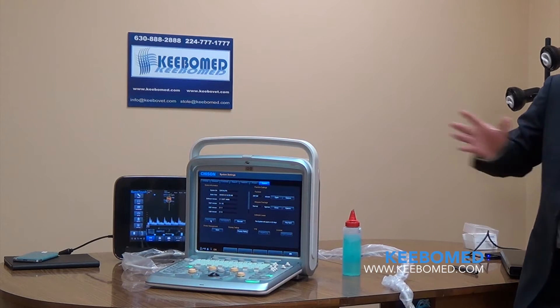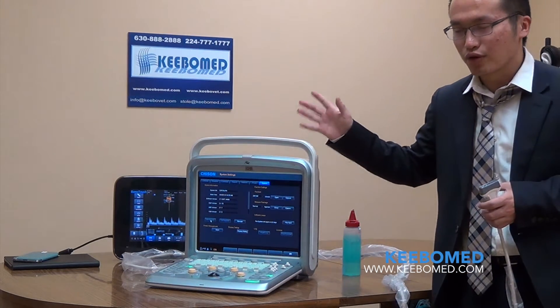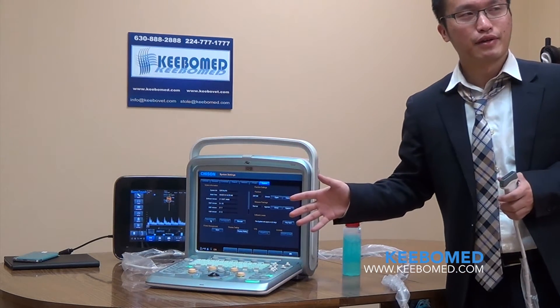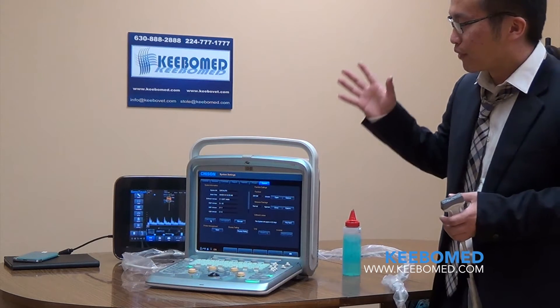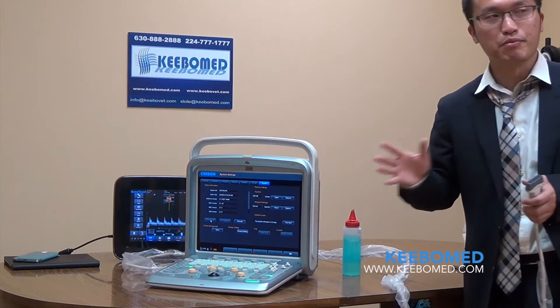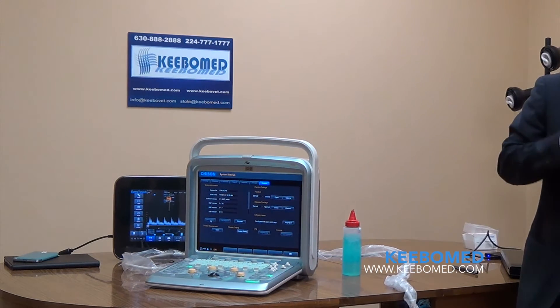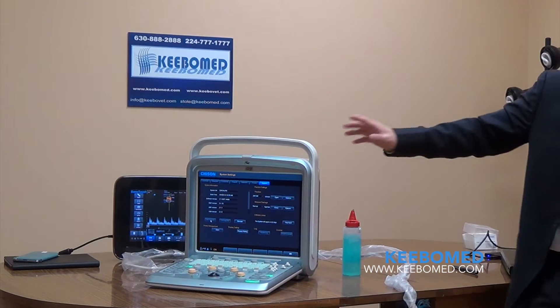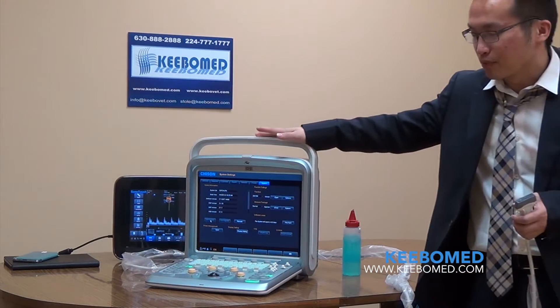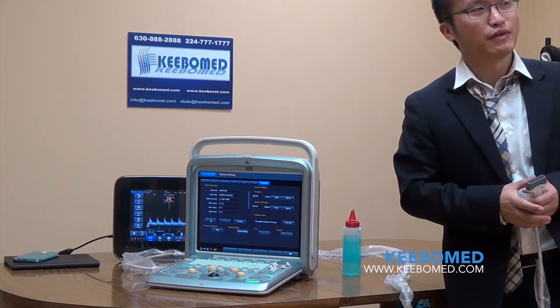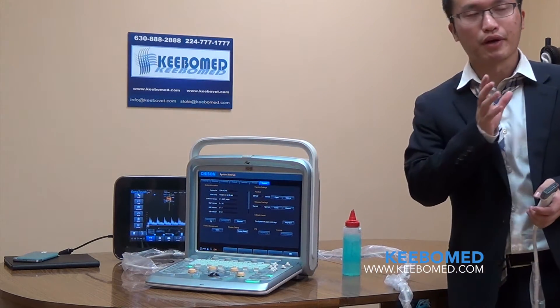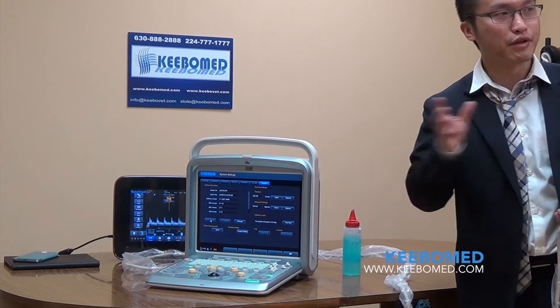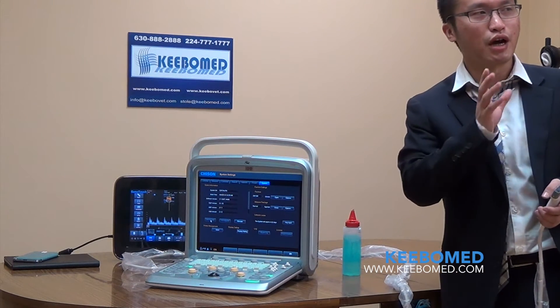Today I bring the new model, the Q9. Let me introduce some new things compared with the Q5. Firstly, this model supports continuous wave. It also supports pencil probes, which allows you to sell this machine for cardiology applications.